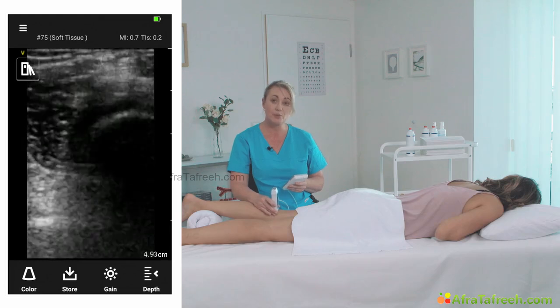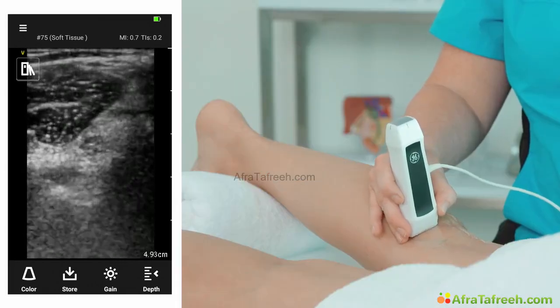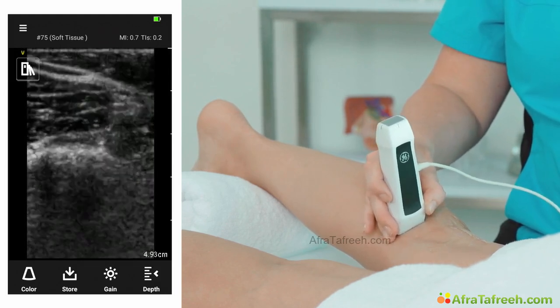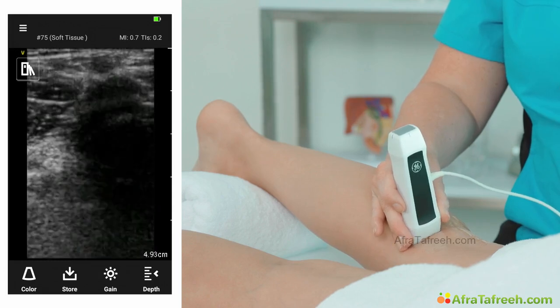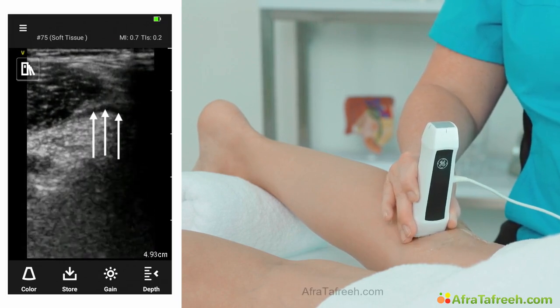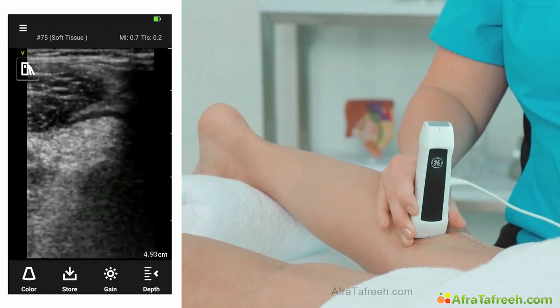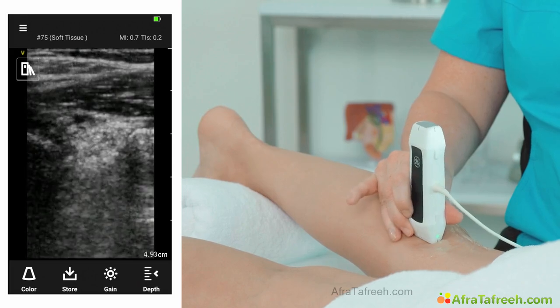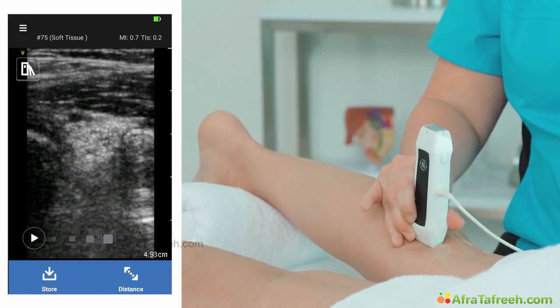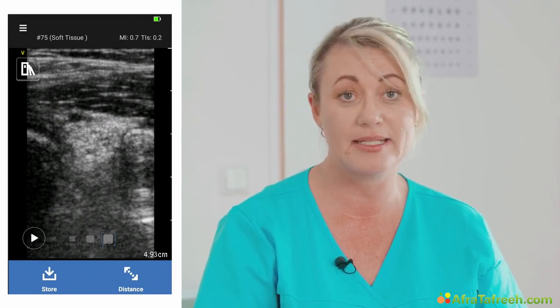As we slide up, we're looking for fluid to pool around that edge of that gastrocnemius muscle. And now I'm going to slide down towards the calf, again looking for fluid in that gastrocnemius muscle area. Back up again. Here we can see a tiny slither of fluid just underneath that gastrocnemius muscle. Is it an artifact, anisotropy, or is it real? So we're going to rotate into a longitudinal plane and sliding through that area. And there's possibly a tiny amount of fluid present in this region. It may not be causing the patient any symptoms, but it's something to be aware of.